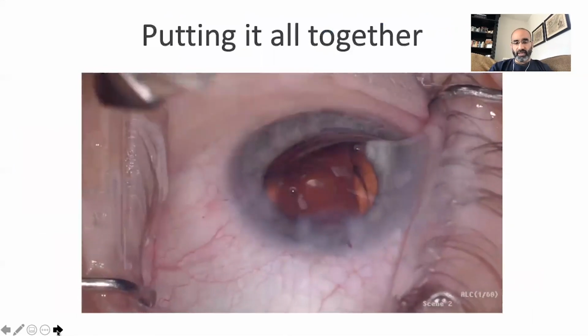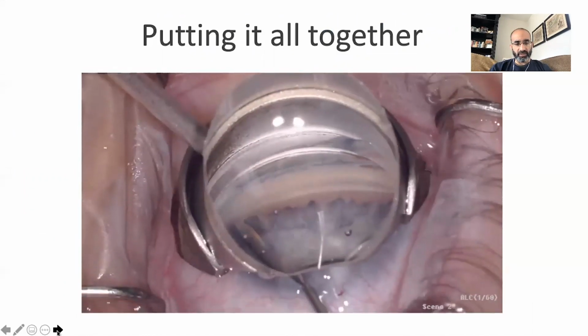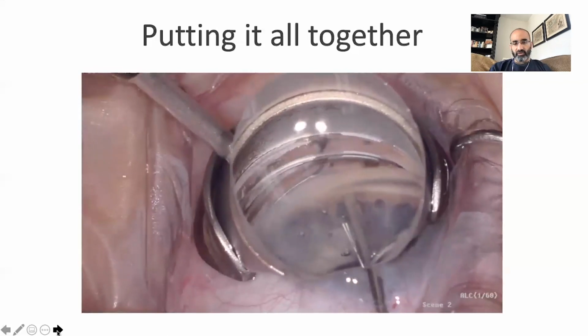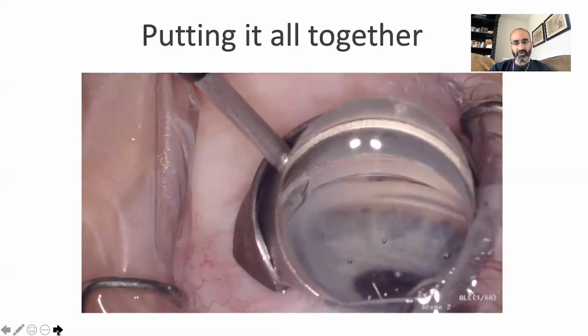And this is putting it all together. This is my friend John Berdal from South Dakota doing his first goniotomy procedure with this device. This is the KDB device. Going left to right, after putting the gonio lens on top of the cornea, you can see it's pretty smooth. He was an experienced angle surgeon before doing this.